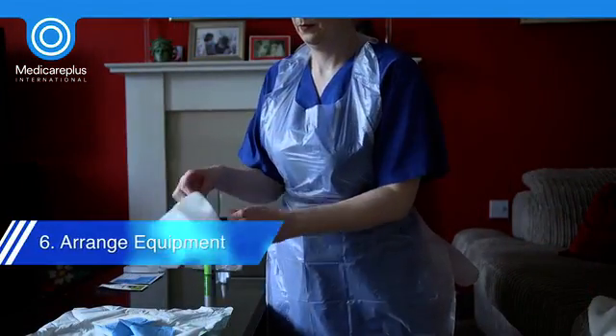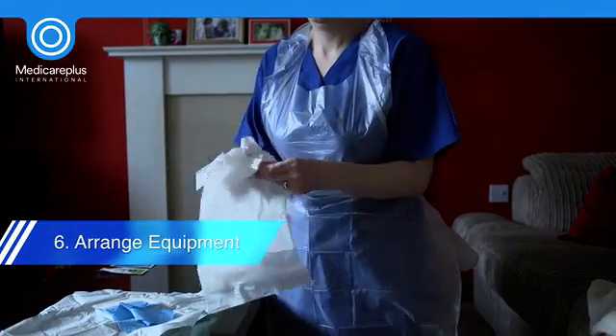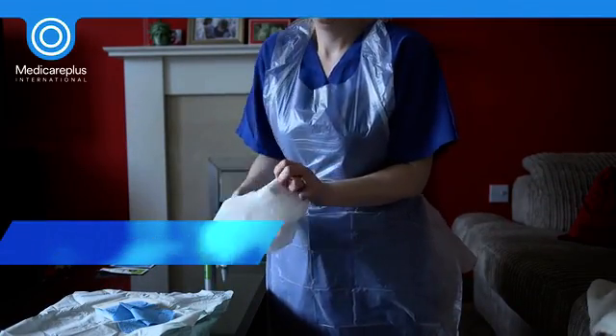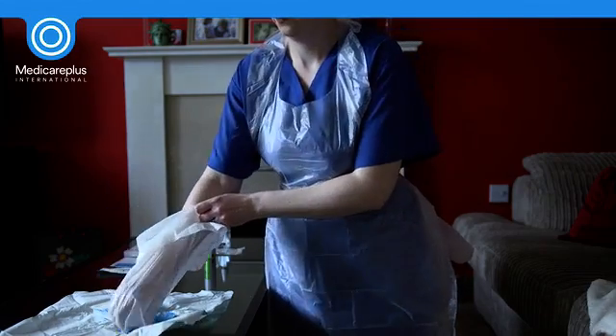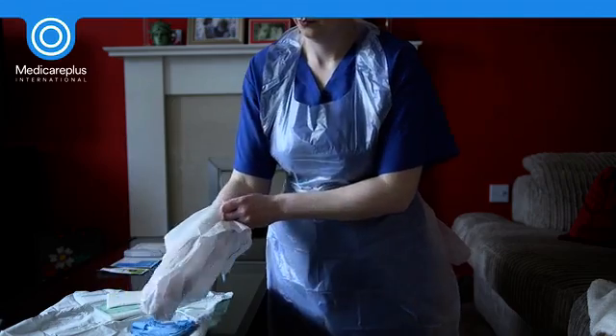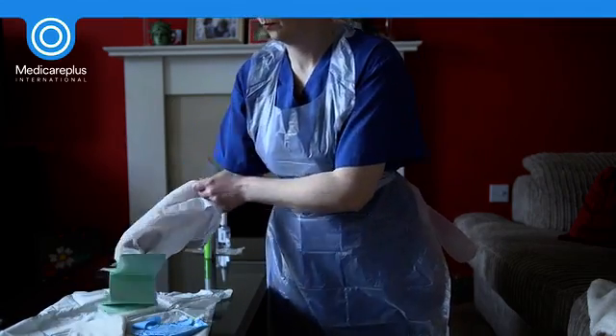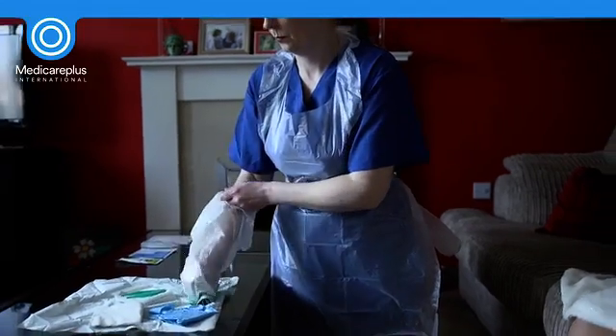The equipment should be removed from the packaging using a non-touch technique. Identify the waste bag first, and then the hand-inside-the-waste-bag technique can be used to arrange the required items in an orderly manner on the sterile field. All of the dressing equipment should be considered as key parts and kept protected at all times.